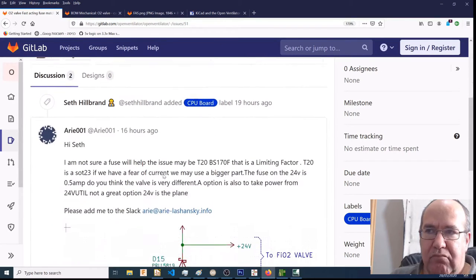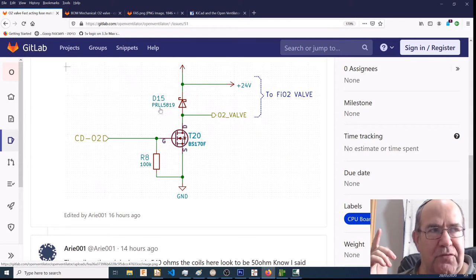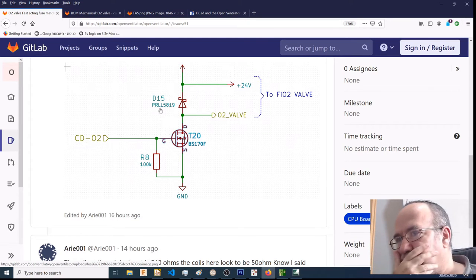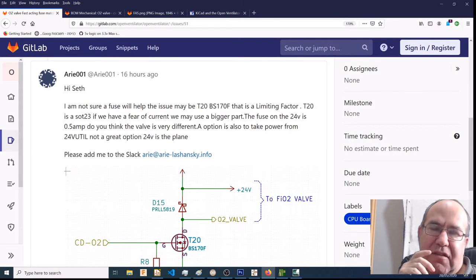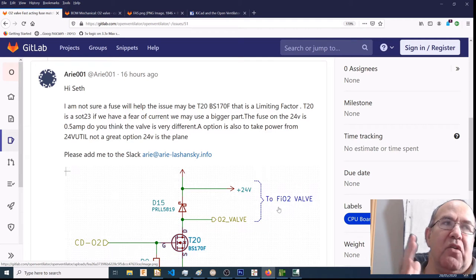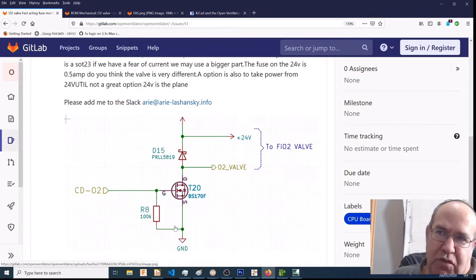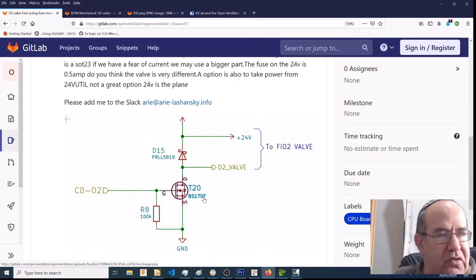I showed you what we're talking about, off the 24 volt line after the fuse. So my comment is that if we're upping the current on the FiO2 valve, we're upping the current to approximately 500 milliamperes. I'm not sure that the BS170F is going to handle the extra current. It's only a SOT23 device. I might be right, I might be wrong, but it's a question if this is going to be able to handle the extra current.